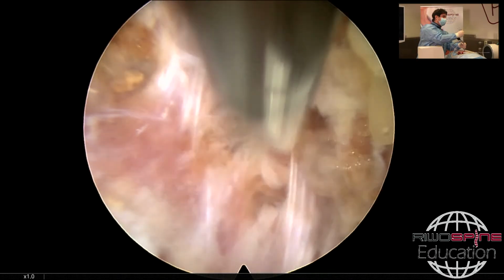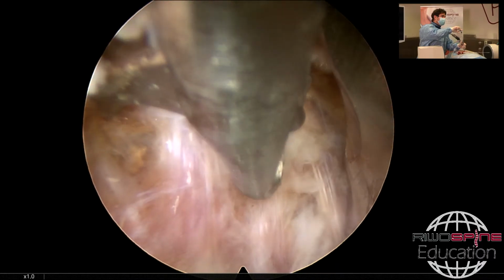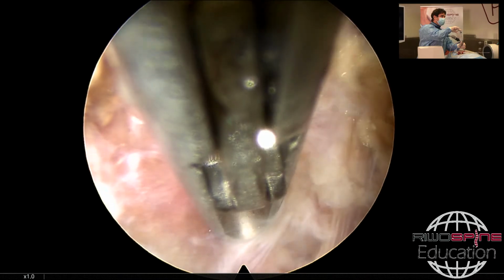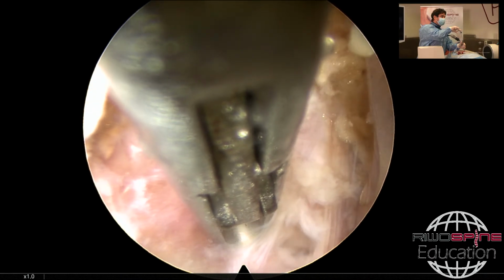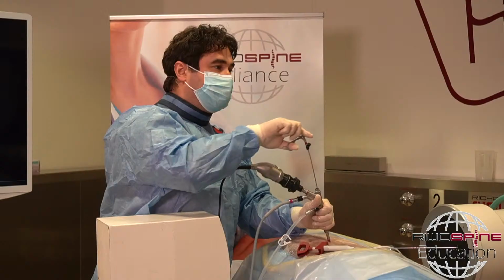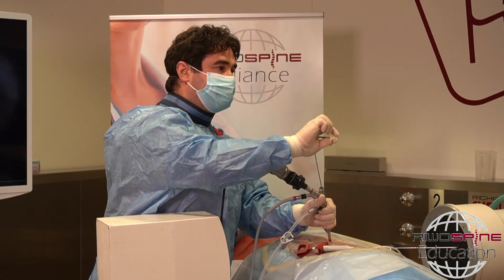Then I just go with the scissor, and every time I would like to see what I'm doing. If I use it straight like that, I don't see what I'm doing, but I keep the direction of the instruments and I rotate my endoscope a little bit to see the tip of the instruments, what I am doing.